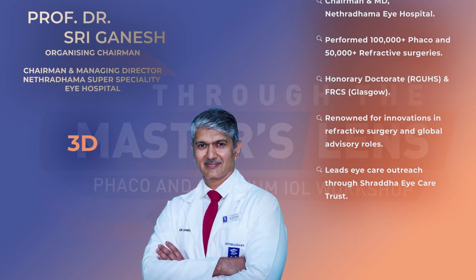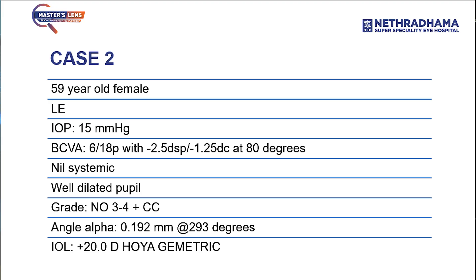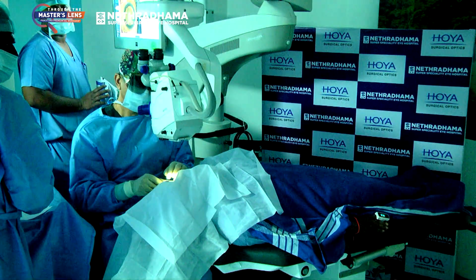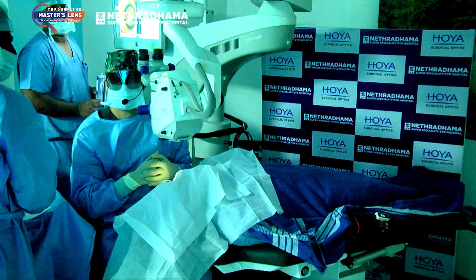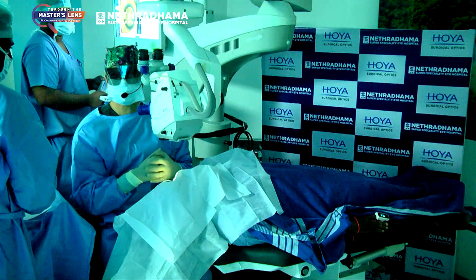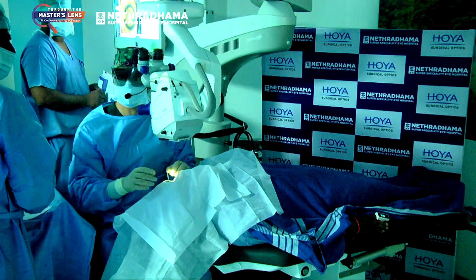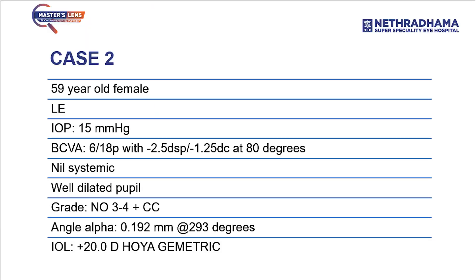Our next operating surgeon is Dr. Sriganesh. He will be operating on a 59-year-old female, left eye. The patient doesn't have any systemic illness. The grading of cataract is NO 3-4 with cortical cataract, and a +20 diopter Hoya Gemetric lens will be implanted. The capsulorrhexis was a femto-rhexis — congratulations on that.